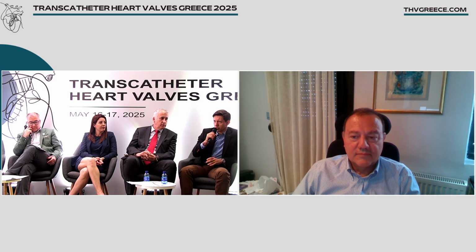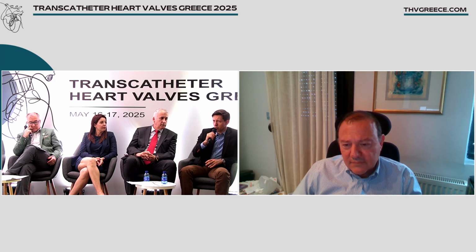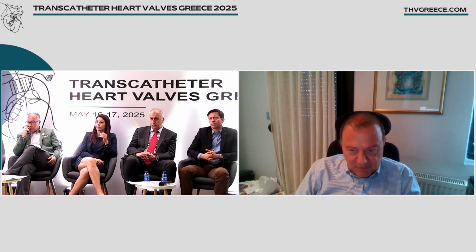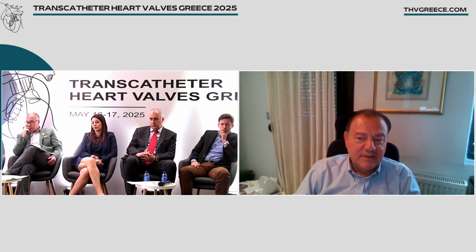Very nice case. One question. If the trick with pulling the balloon of the valve didn't work, what would you have considered? Perhaps, I don't know, a balloon from the left femoral? Yeah, maybe a balloon from the left femoral, so as to change the orientation, half inflated or even with no inflation.